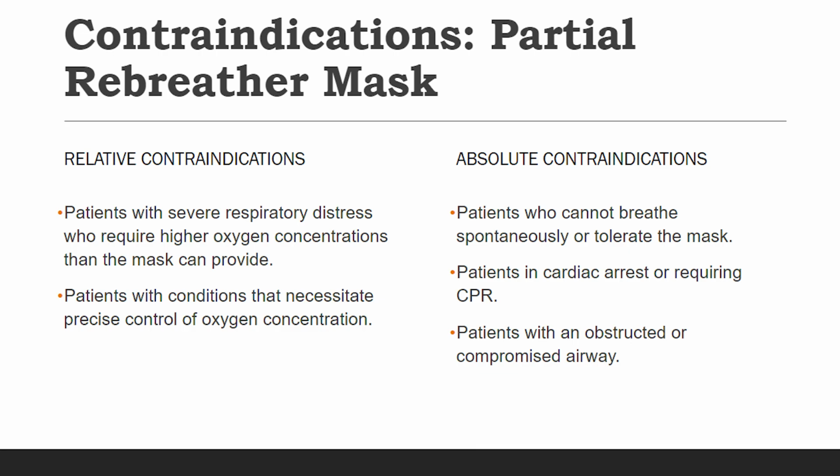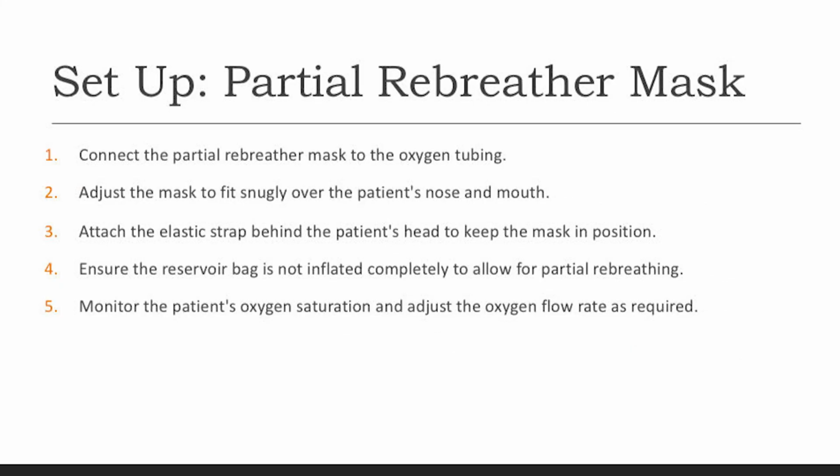Understanding these contraindications ensures safe and appropriate use of the partial rebreather mask in patient care. Proper setup of the partial rebreather mask. Setting up the partial rebreather mask is straightforward, much like the non-rebreather mask.